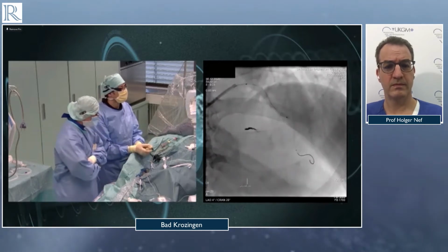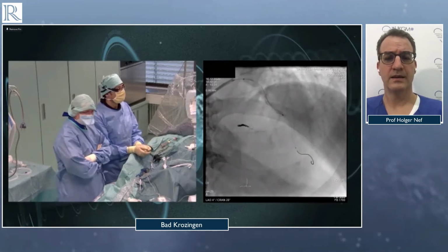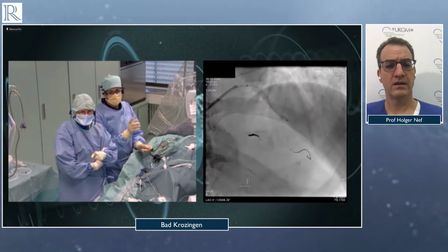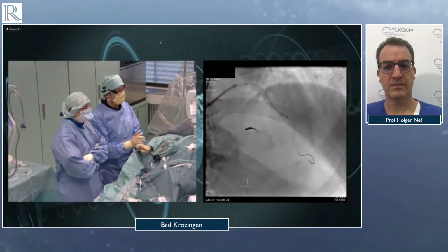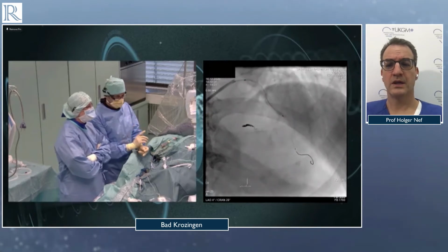Definitely, yeah, will be suitable, right? Yeah. So we are now ready to show OCT pictures. But Holger, do you have any questions?